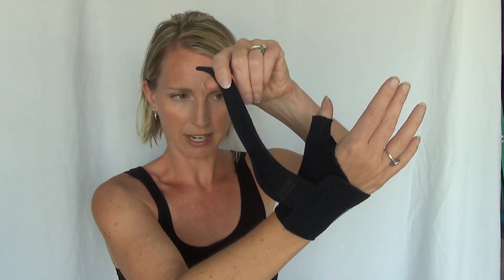I love this splint because it wraps around the thumb and there's velcro right here that supports the thumb. Then this little piece comes through your thumb web space, and there's more velcro on the back here that holds that piece together.